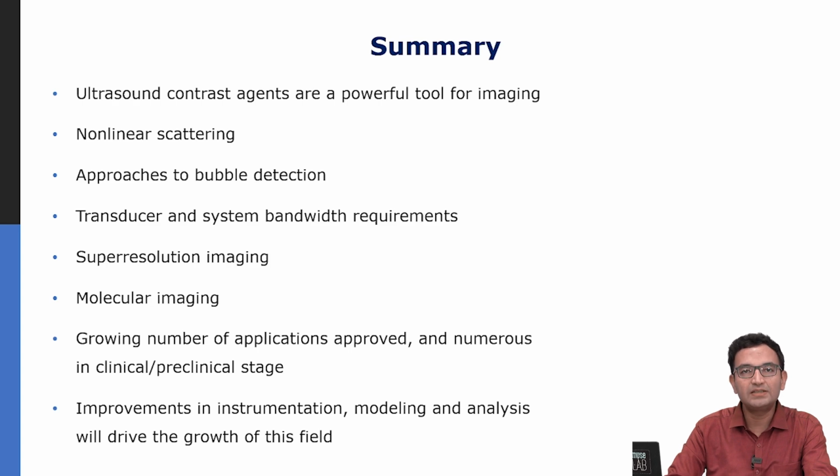So let me summarize the contents of this lecture. I hope I have convinced you that ultrasound contrast agents are a powerful tool for imaging. We discussed the nonlinear scattering from the contrast agent and approaches to bubble detection, including some very simple approaches such as pulse inversion, power modulation, flash contrast agent imaging, etc. We discussed the transducer and system bandwidth requirements for contrast enhanced imaging. We discussed the exciting fields of super resolution and molecular imaging.